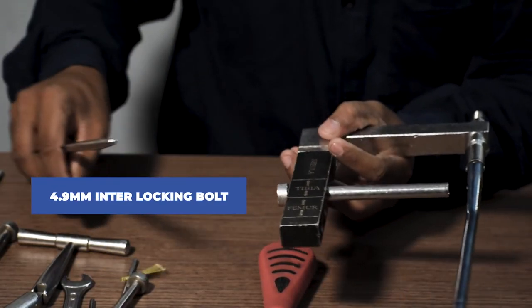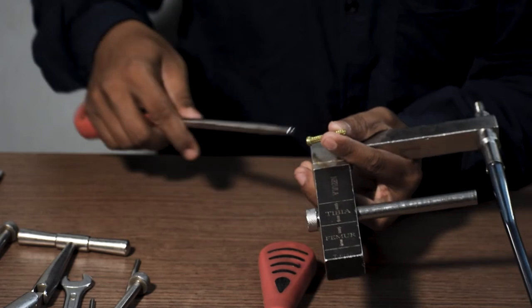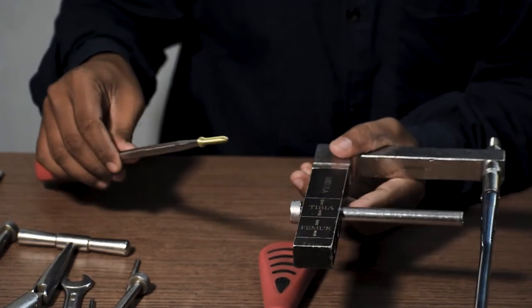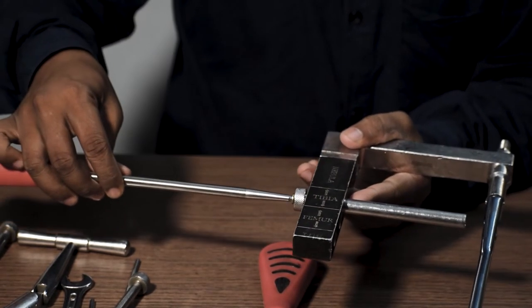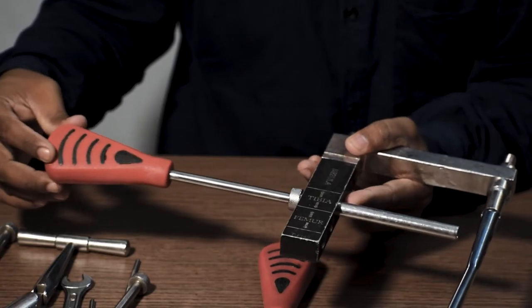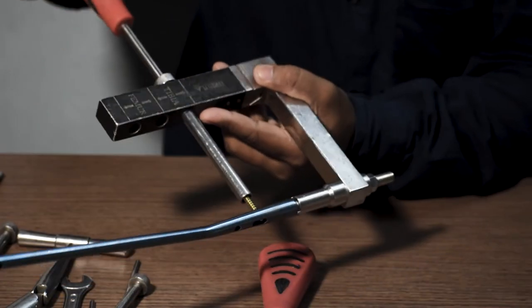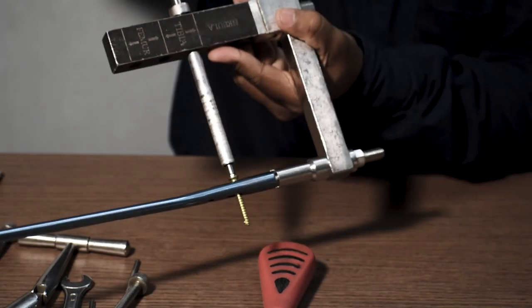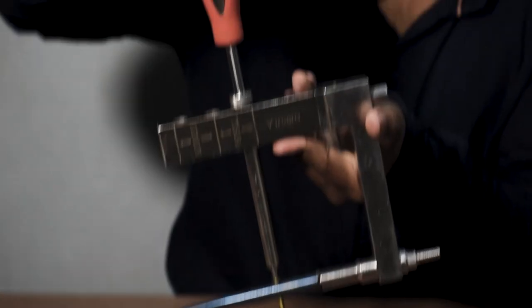A 200 mm screwdriver is used in order to fix the interlocking bolt in the proximal part of the nail which is connected to the jig. A 4.9 mm interlocking bolt is used. The entry is done through the protection sleeve using the 200 mm screwdriver and gets locked in this hole.